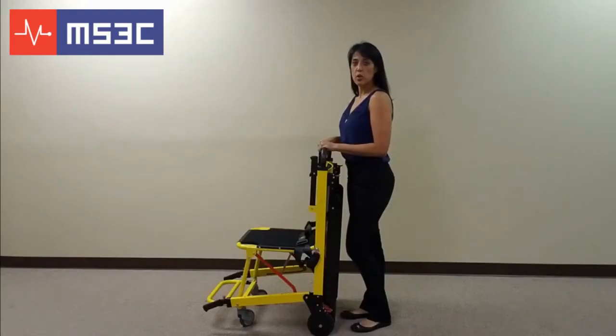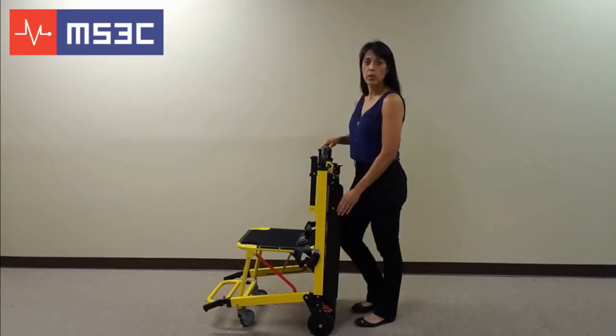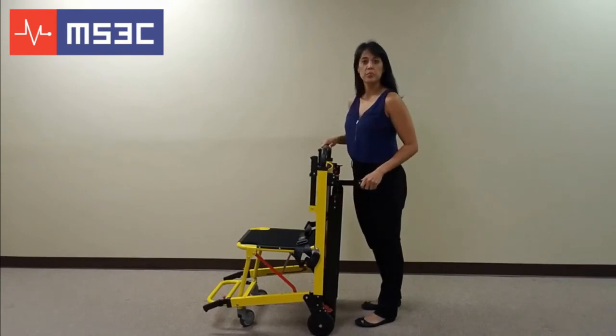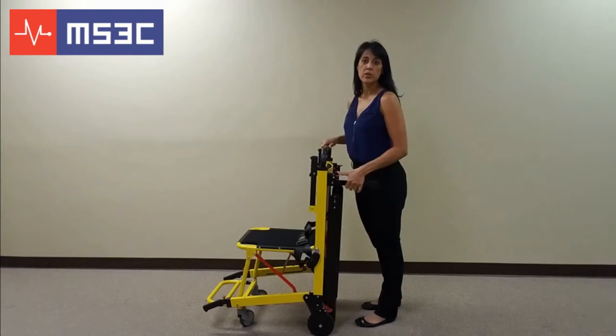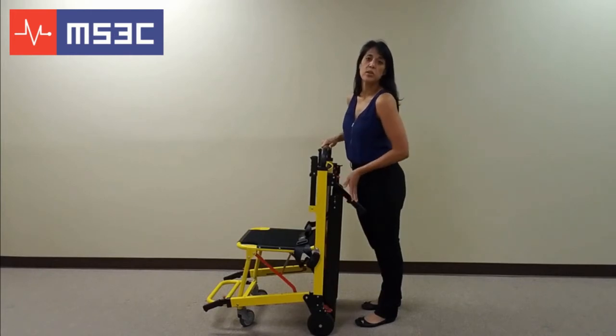There are several control handles on this evacuation chair. The locking rear push handles are used to push the chair. To engage them, simply pull up until they are in the locked position. To release them, push the red lever located at the top of the handle and fold the handle into its original position.